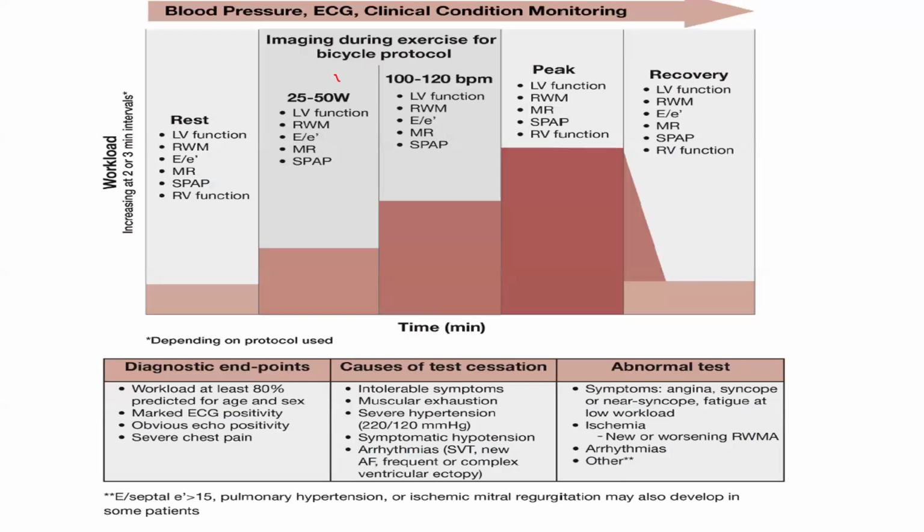Now, if you look at this, essentially a patient has come for a stress test, you've checked your indications, the name of the person, and the contraindications. You make sure the indication is right, and your patient is on the treadmill. If you are going to use a treadmill test, before they go, you've done your baseline 12-lead ECG, you've done your BP.